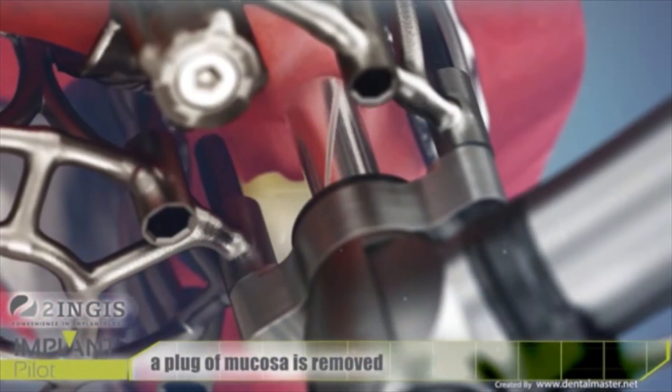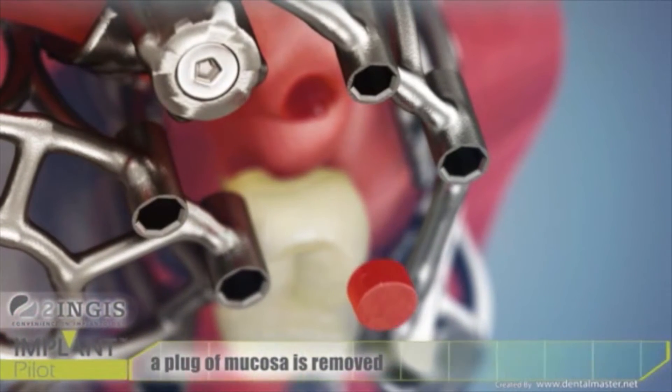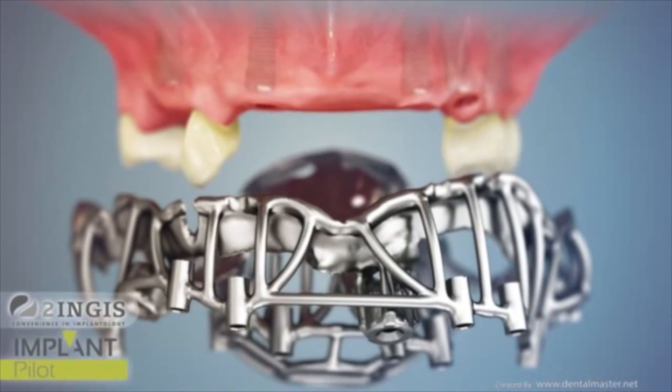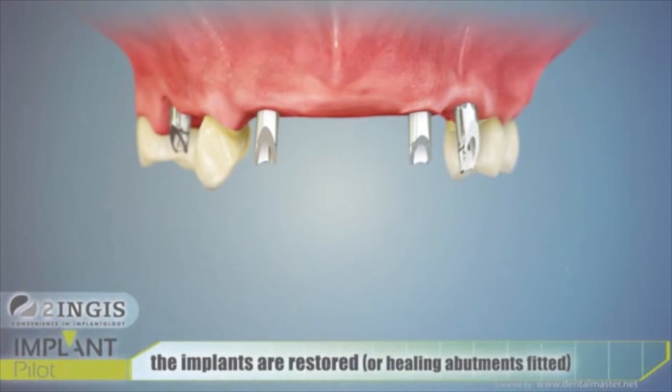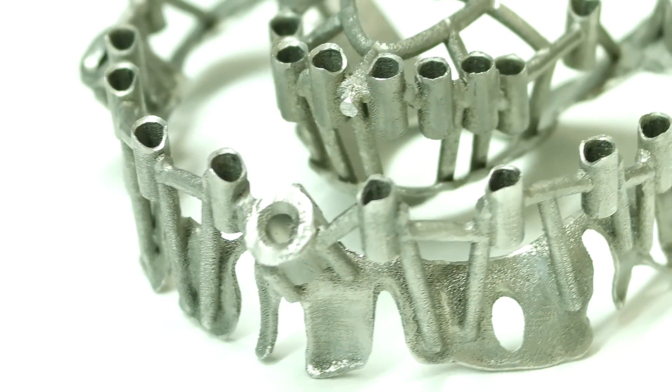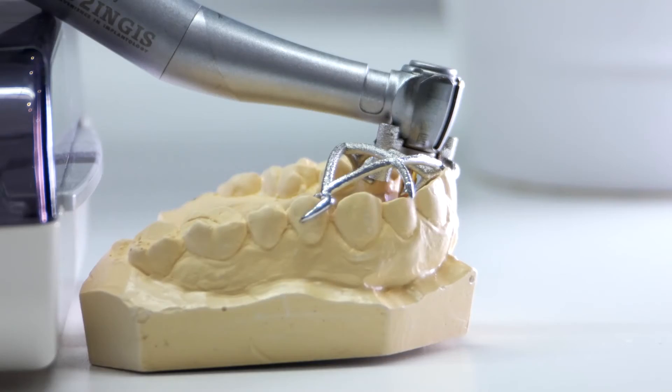The big advantage is that it shortens the surgical time extremely, which is very important for the patient — the shorter the surgery, the less the swelling. Thanks to guided surgery, we can do most cases as flapless surgery, meaning you don't need to cut and you don't need to suture. Patients who had this experience, and previously had cutting, say 'never again like before' — they really appreciate the guided surgery.